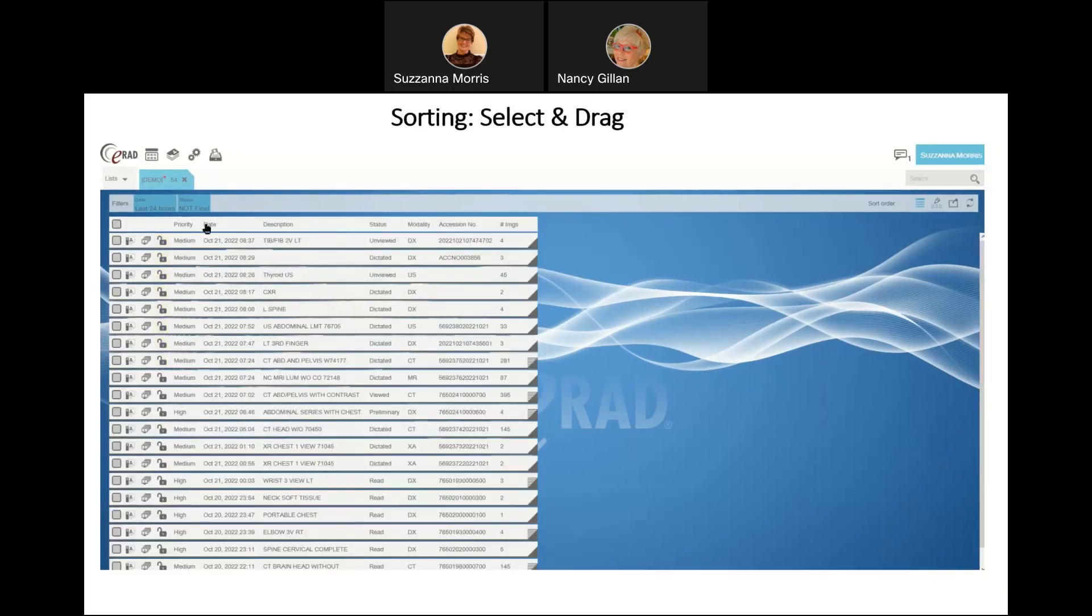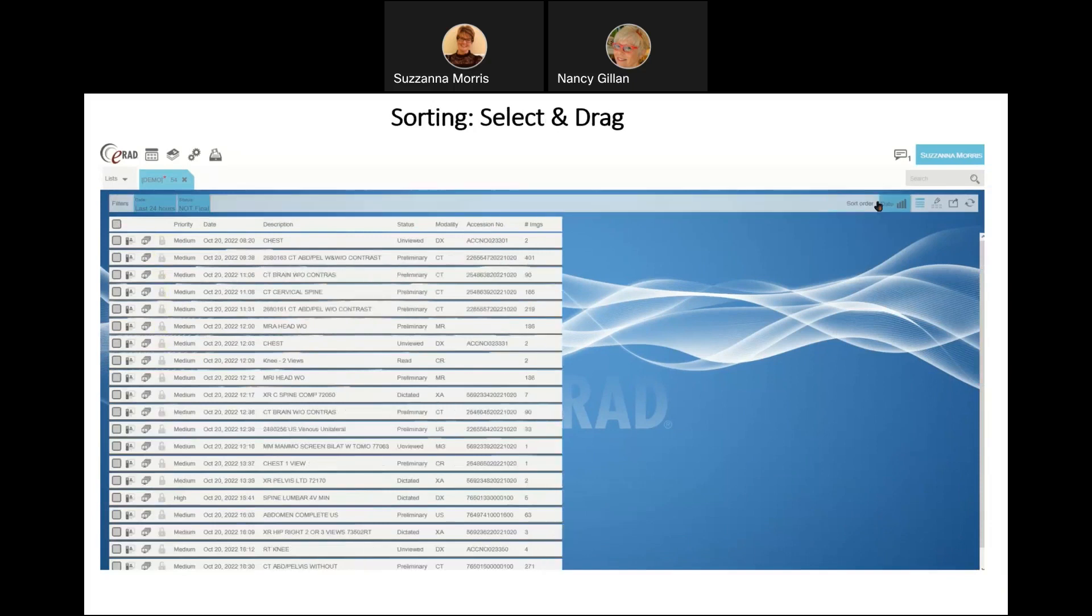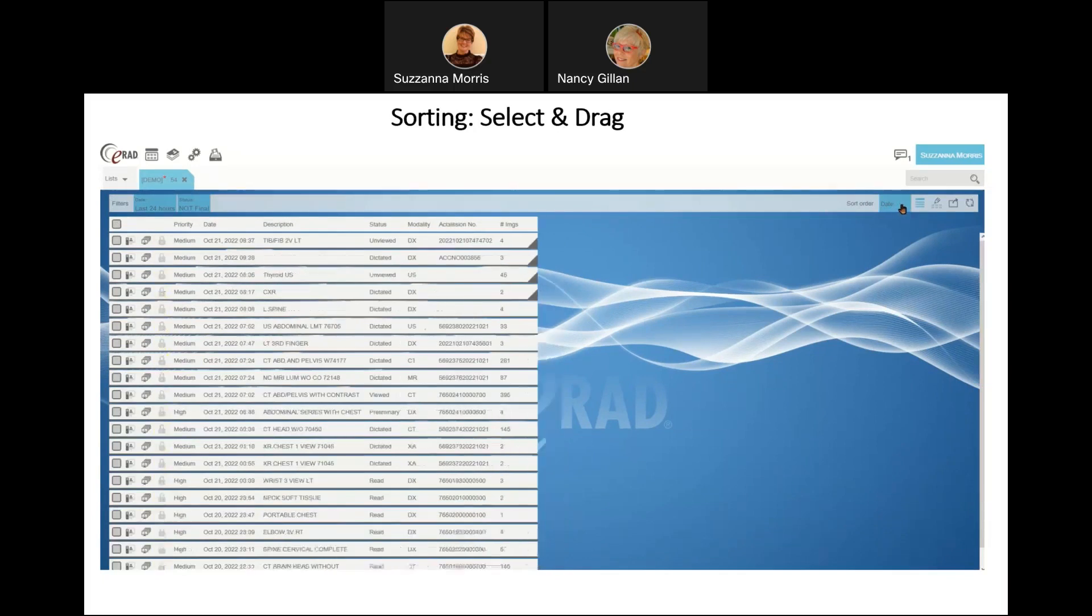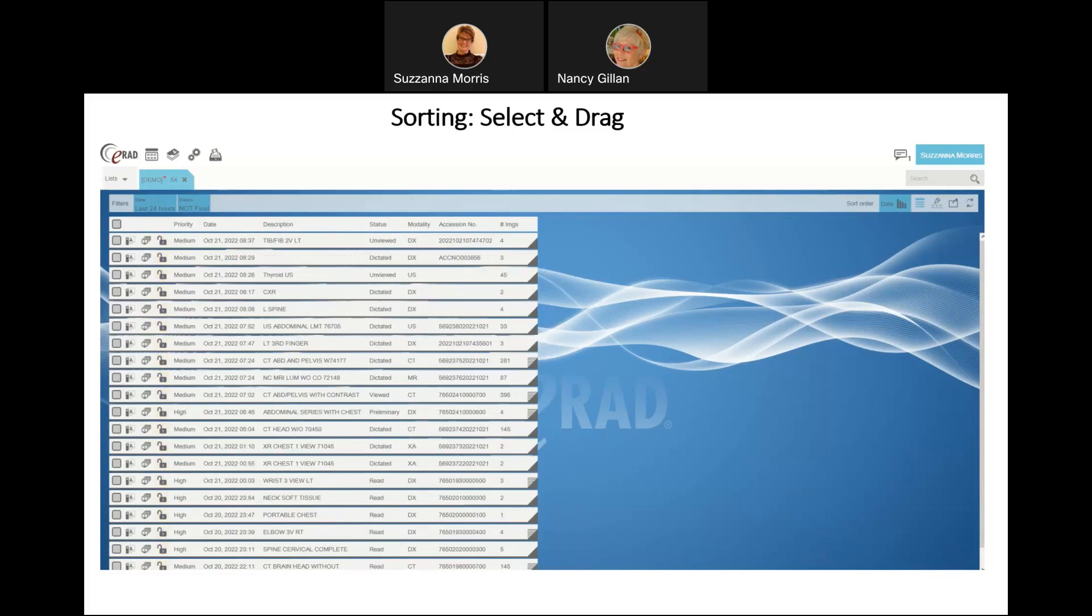Once we have all of our filters selected, it's important for you to sort the data so that it makes sense. You can sort by chronological order, alphabetical order, just about any way that you'd like. There's a couple ways you can do that. Click and drag. I'm selecting date and dragging it over to my sort area, and you can choose either ascending or descending by simply clicking on that date up in the sort area, and it changes it from ascending to descending or vice versa.